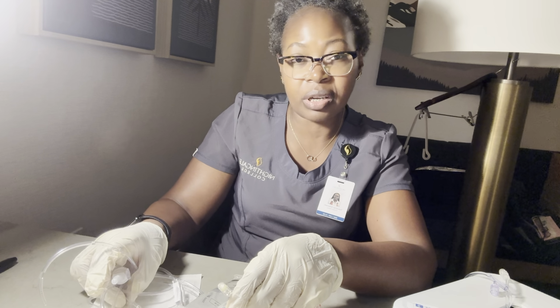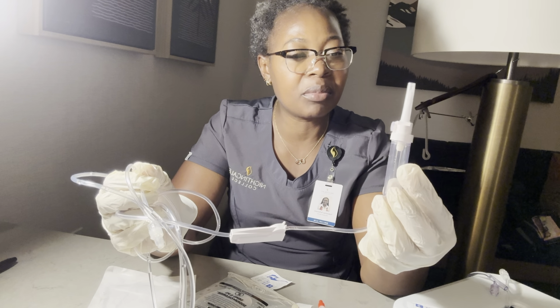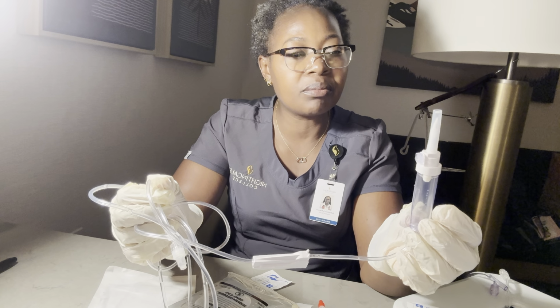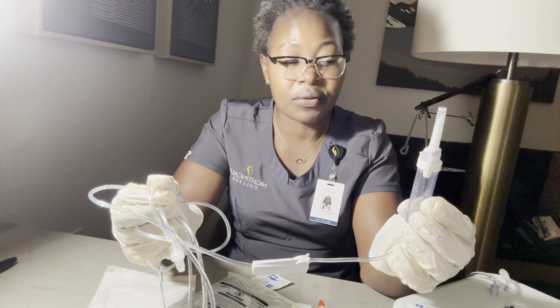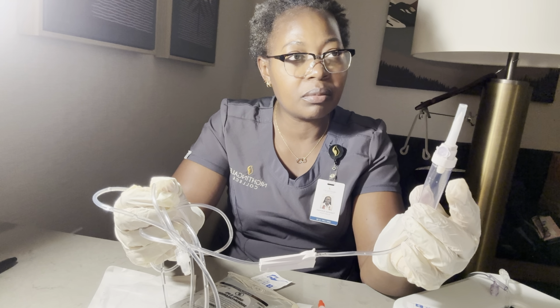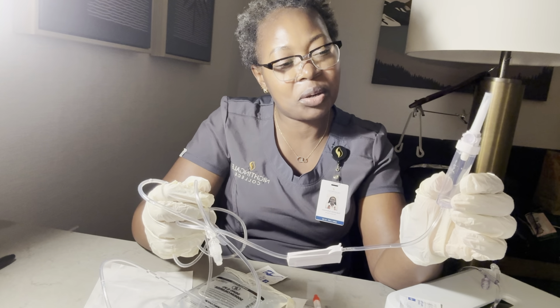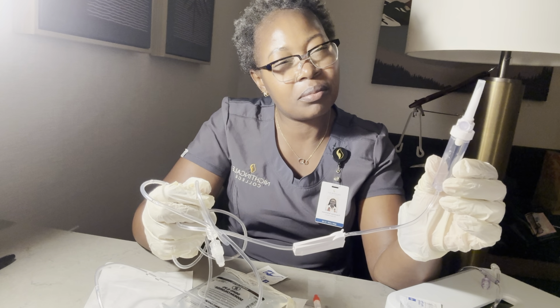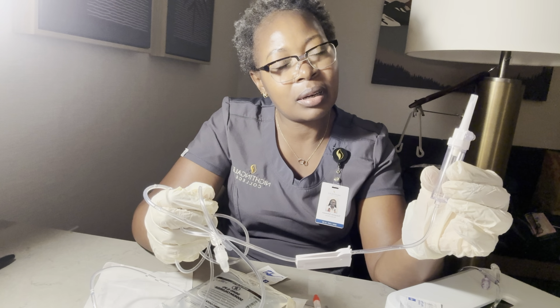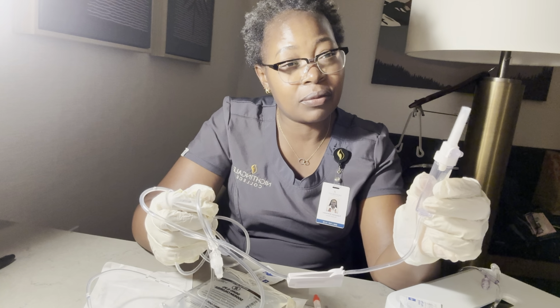I have a micro drip, which I'll be using today, and with my micro drip there's a spike which is supposed to remain sterile, because it's what I'm going to be introducing to the fluid. With the tubing comes the drip chamber. With the drip chamber, this is where I'm going to be able to visualize my medication. It is basically used to prevent air, visualize the flow rate, and also to help me count the flow rates.